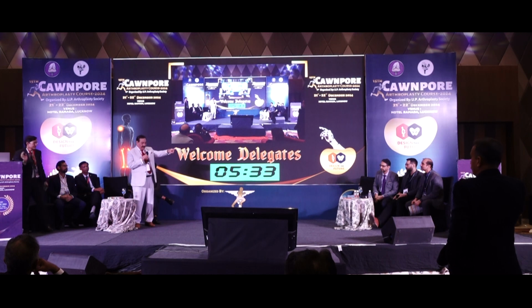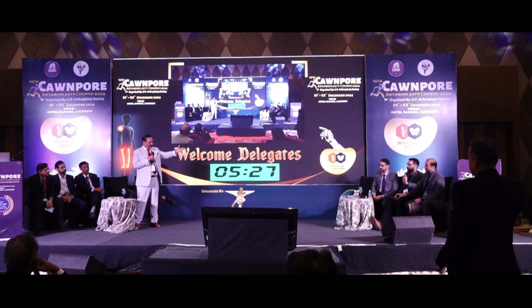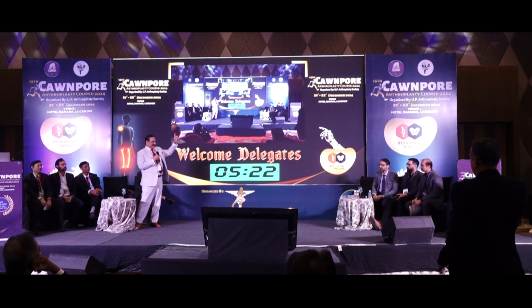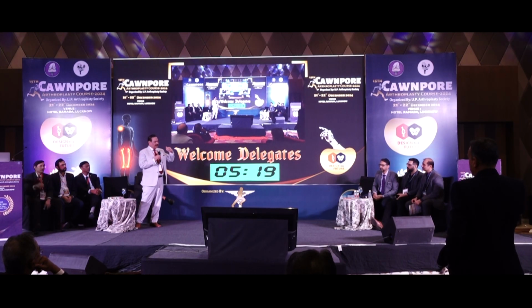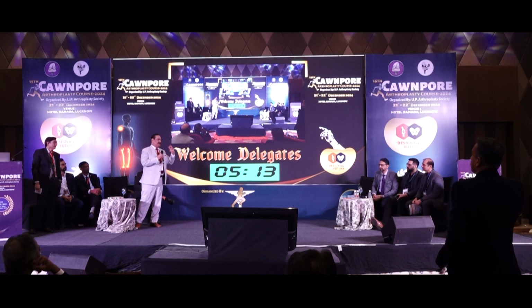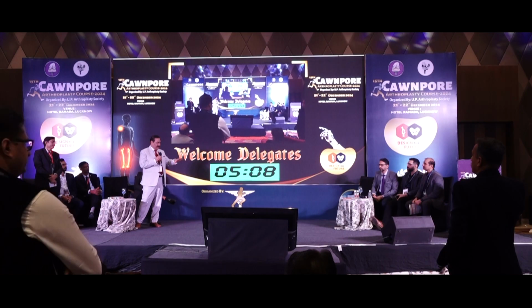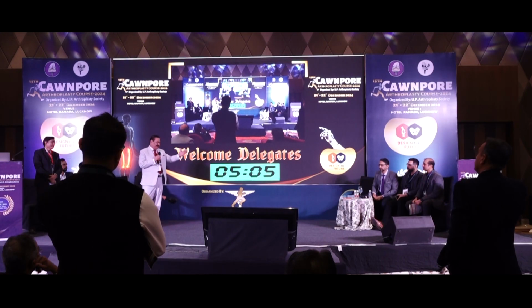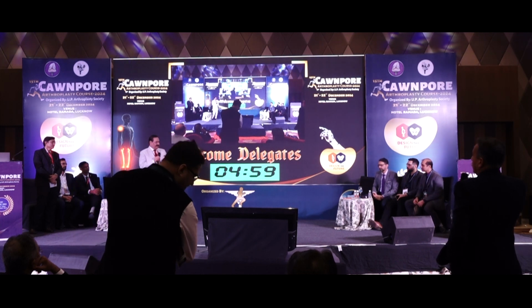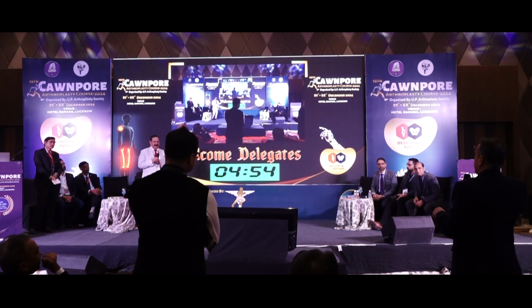See, there is no way to predict, but poor bone quality and gradual remodeling with weight bearing will happen. That's a separate story. You are talking of gradual production of protrusio because the medial wall is going in. It can only happen if anybody puts a very tight one, because we tend to put not tight bipolars. Number two, poor bone quality. And third, I imagine somebody might have done it in inflammatory arthritis. I have seen people doing a bipolar for fracture neck femur even in inflammatory arthritis, though not indicated. Soft bone, I think, is the answer.